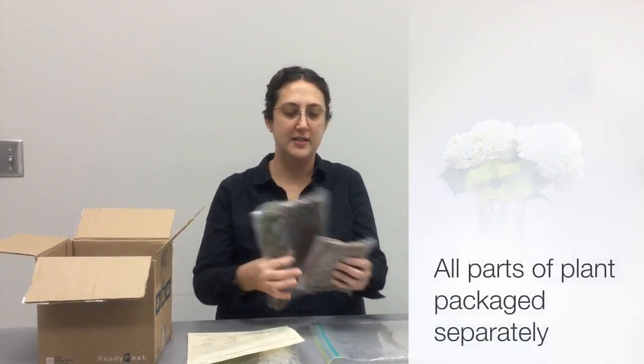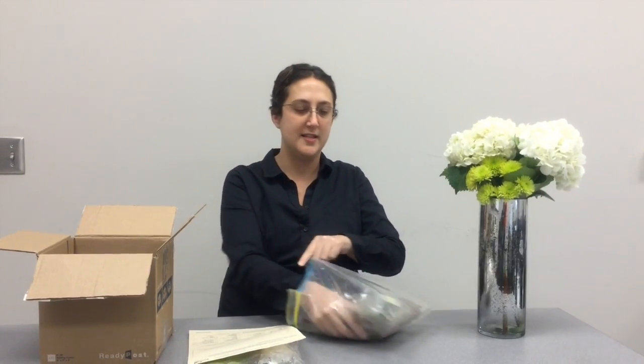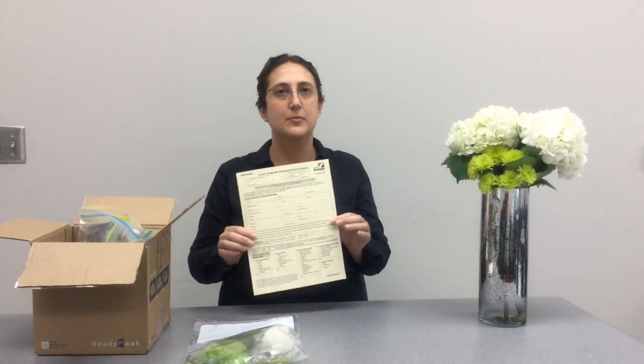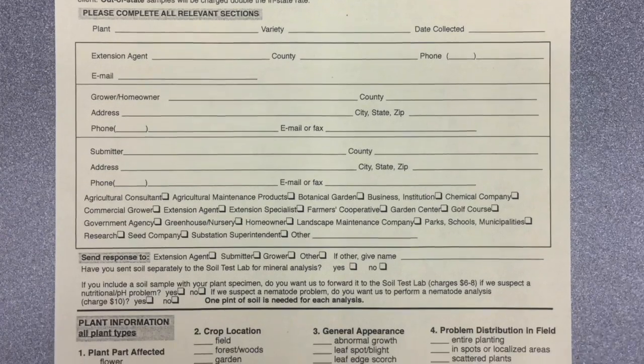When packing and shipping samples, all parts of the plant should be packaged separately in separate bags, and they should all be placed into one single bag. The samples need to be put into a sturdy shipping container and the plant sample submission form needs to be filled out and sent in with it.